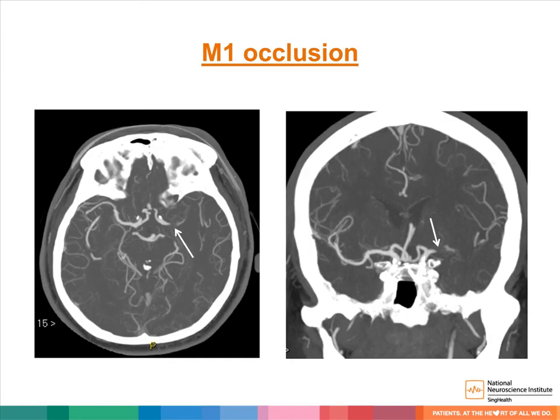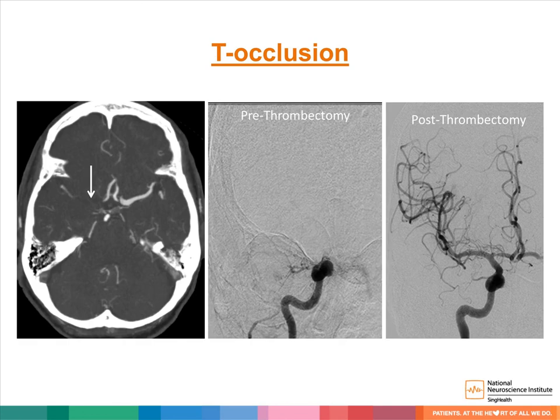In patients presenting with acute ischemic stroke, CTA of the Circle of Willis is performed to identify patients with large vessel occlusions who may benefit from thrombectomy. It is also useful to exclude any other stroke mimic. In this patient, we see an occlusion of the M1 segment of the left middle cerebral artery. This example shows an occlusion of the distal internal carotid artery, with also occlusion of the proximal anterior cerebral artery and the proximal middle cerebral artery on the right side — this is an example of a T occlusion.